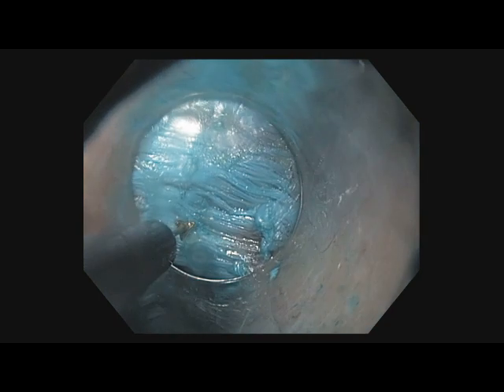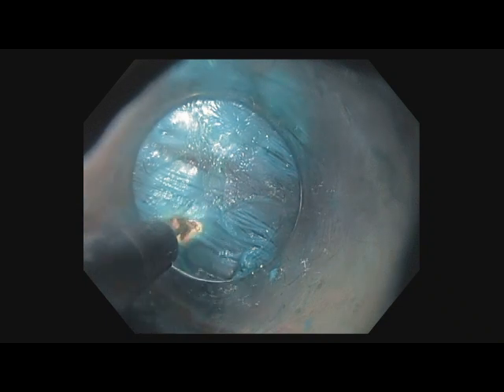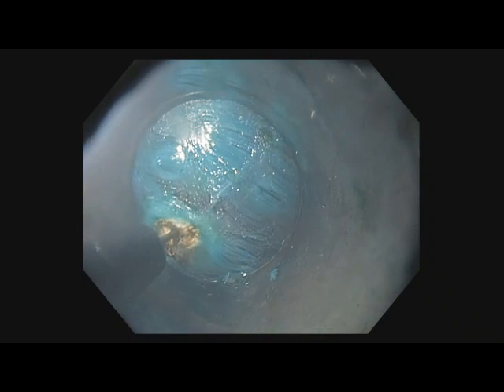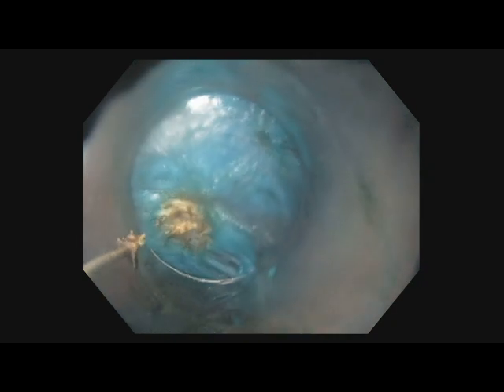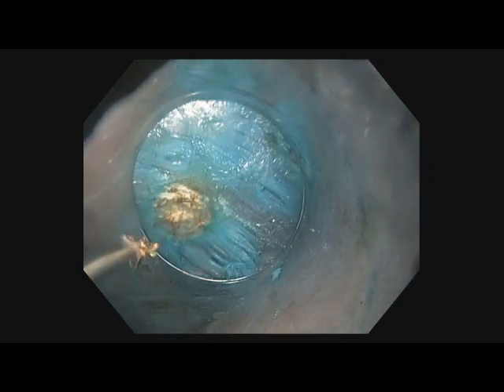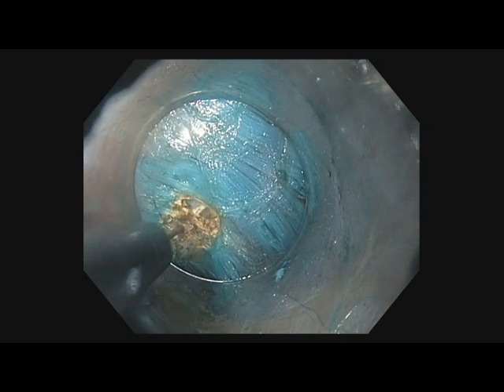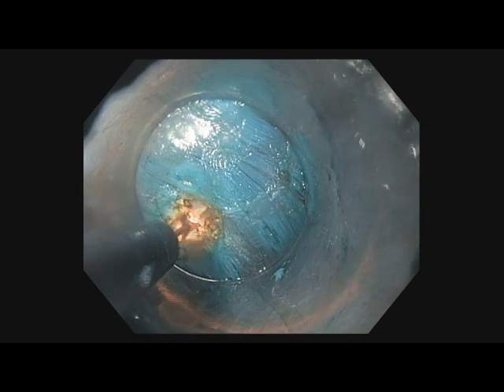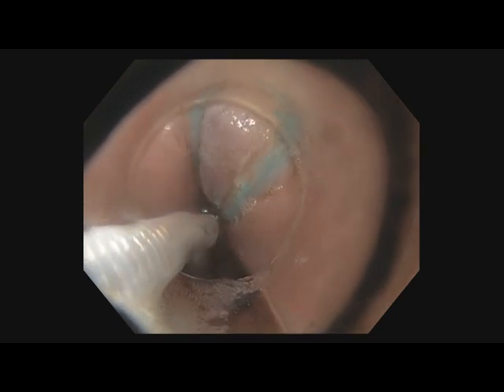After submucosal tunnel creation, a selective myotomy of the inner circular muscle layer of the esophagus is started at 30 centimeters from the incisors and extended on 15 centimeters, ablating both the spastic segment as evidenced by manometry and the EGJ. After myotomy completion, the mucosotomy is closed with a series of hemostatic clips.